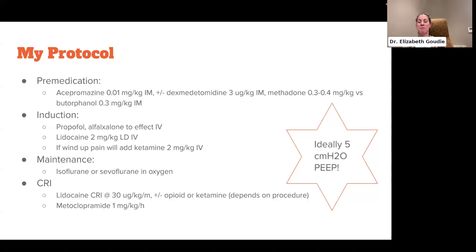Ideally, these patients should be maintained on PEEP, especially if you haven't gotten chest radiographs, or the chest radiographs look pretty bad. The PEEP really helps you with protective lung ventilation, right? So, decreasing the amount of ARDS and respiratory trauma. If you have some positive end-expiratory pressure going on these patients, then it takes a little bit less peak inspiratory pressure, and hopefully you can minimize your atelectasis by providing PEEP. Obviously within limits, right? You don't want to have your end-tidal CO2 too high, and you don't want to compromise maybe an unstable patient that doesn't have a good intravascular volume.